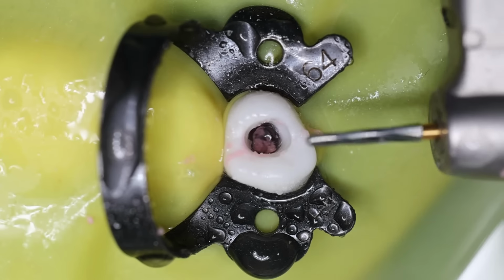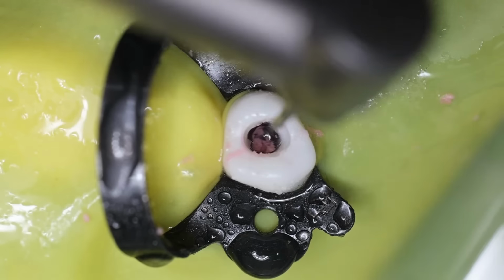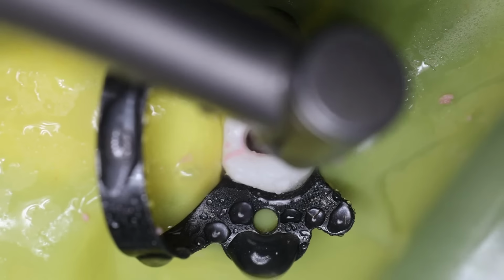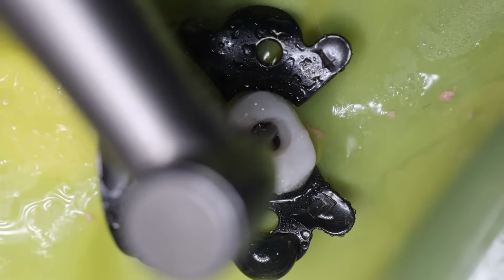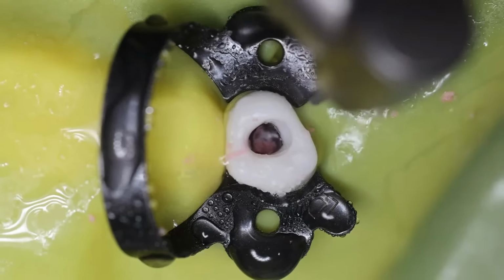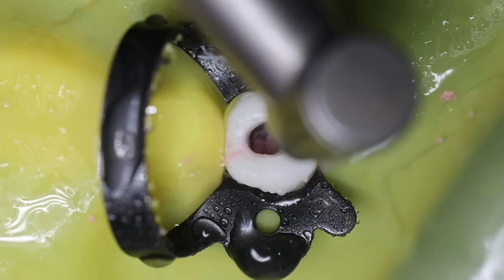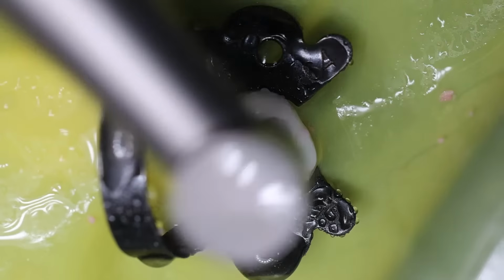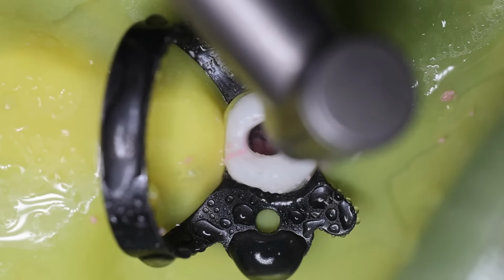It has a round tip and we can enlarge the pulp access cavity, not the pulp chamber. So you don't have to worry about perforations because you are now safely into the roof.